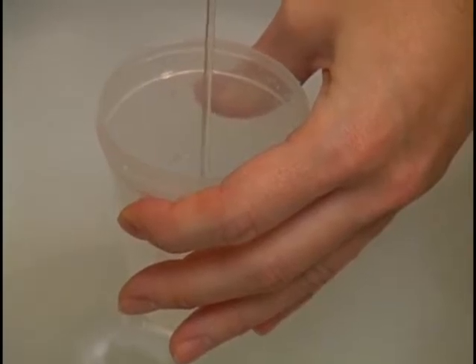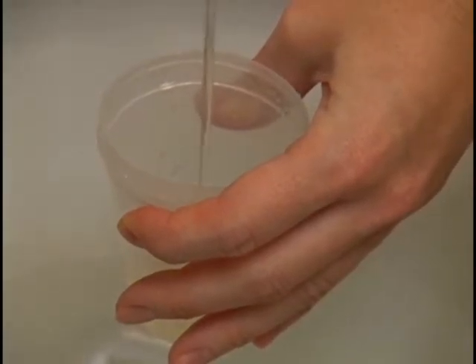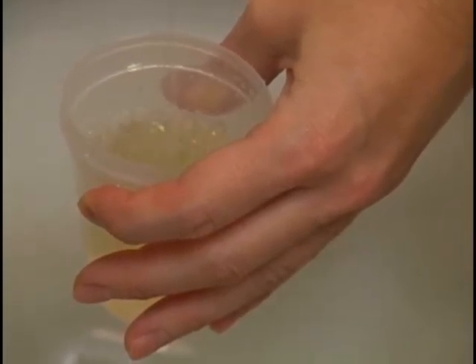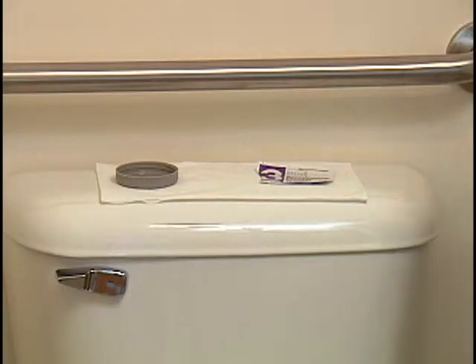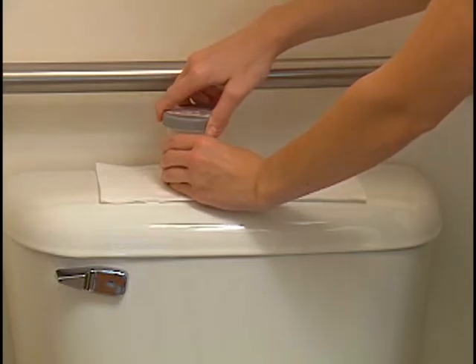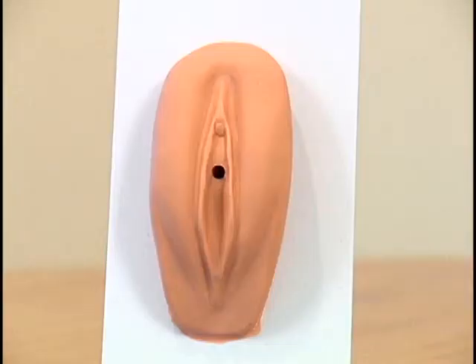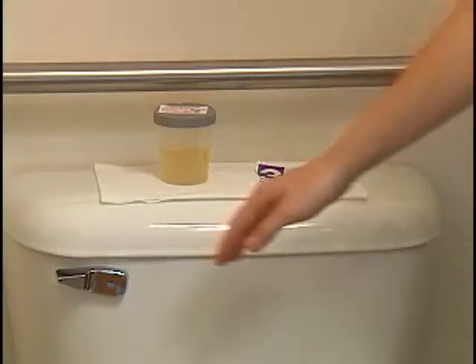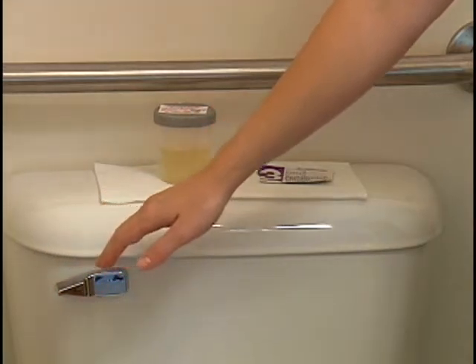Collect the next amount of urine by voiding into the sterile container. Do not touch the inside of the container as this will contaminate it. Fill the specimen container about half full with urine. Void the last amount of urine into the toilet. This means that the first and last portion of the urine flow is not included in the specimen. Replace the lid on the specimen container, making sure not to touch the inside of the lid. Wipe the area dry with a tissue and discard it in the toilet. Flush the toilet and wash your hands.